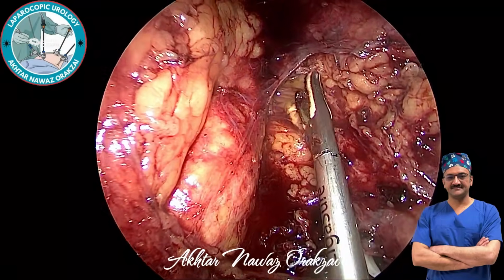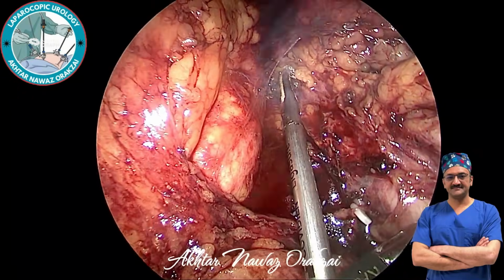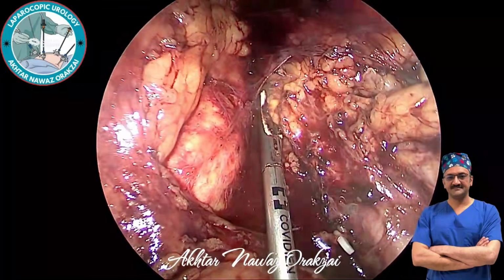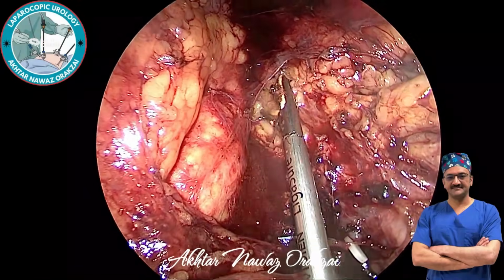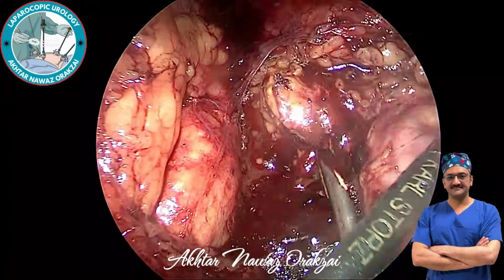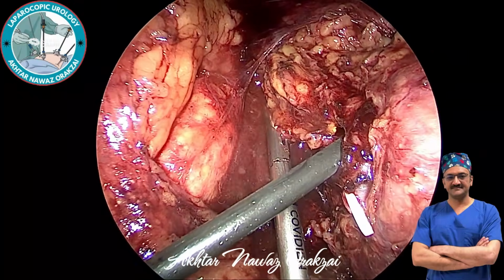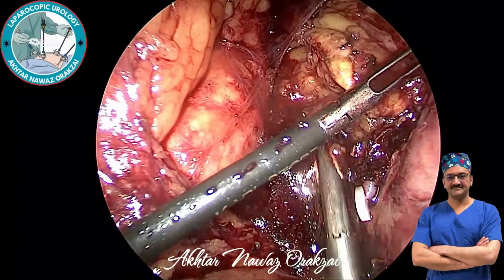However, some surgeons would suggest vice versa. The vein on the right side is quite short. It is draining directly into the inferior vena cava, and sometimes if the gland is too big, it is pushing on the inferior vena cava, and clipping that vein can be a little cumbersome.